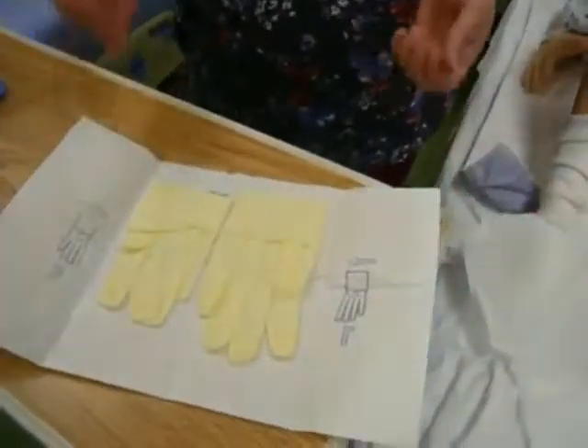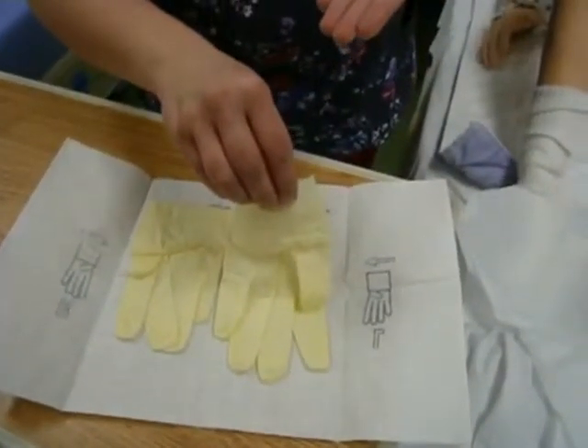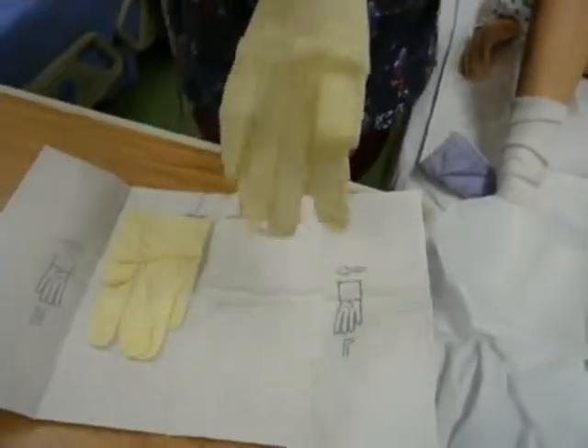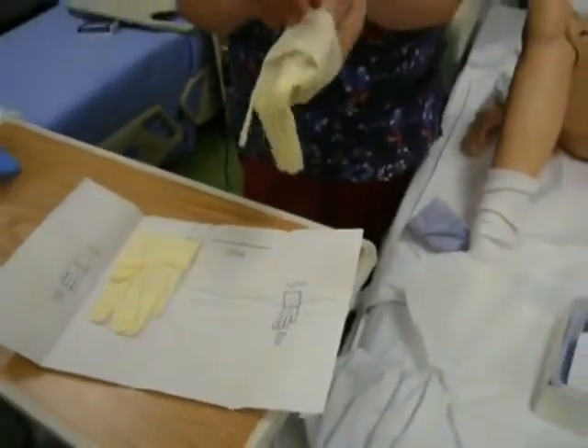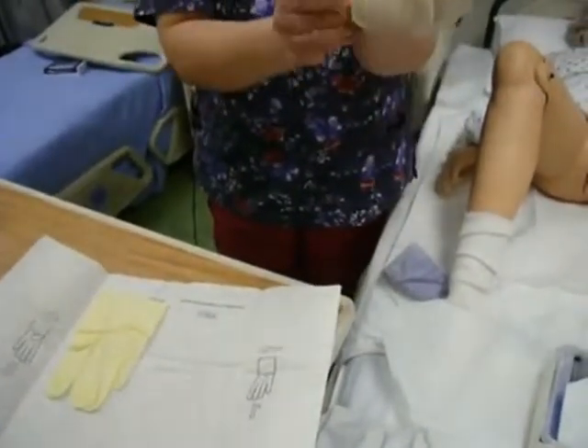Notice I have my bedside table at waist height as well, so that I make sure that I'm not below waist height because it would be considered contaminated. My first glove — I need to come up and off my field, so I'm going to come up and off, take a little step away, and slide it on grabbing the cuff first. If you have any questions about sterile gloving, please make sure you watch the sterile gloving video.